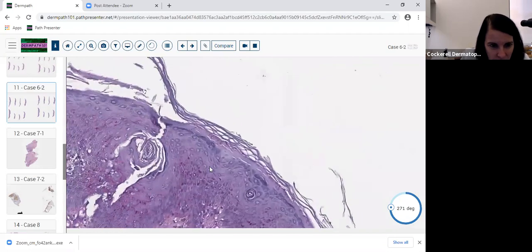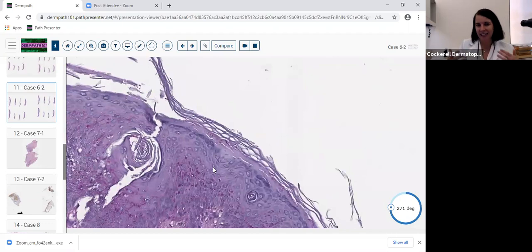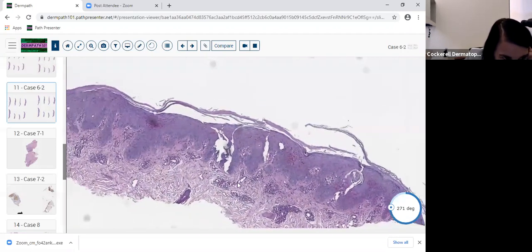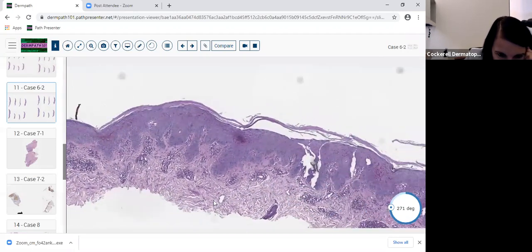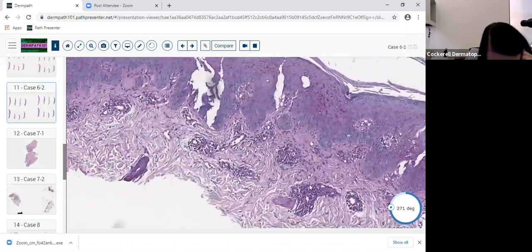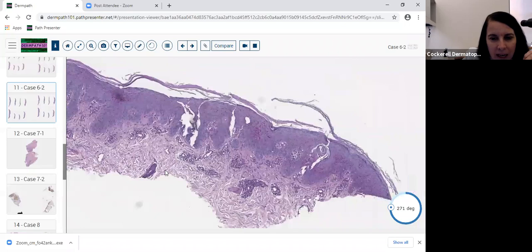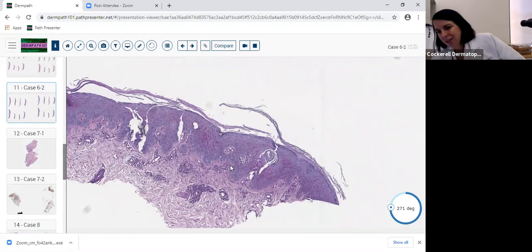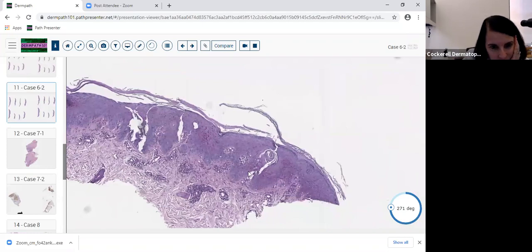Now, when you have a superficial fungal infection, tinea corporis in this case, because it was on the body, if it's tinea capitis, especially in a child, be sure to look in the hairs down here. Take a quick look and try to find some hair. Well, this isn't scalp, so we don't see much hair that we can look at. But you want to make sure you don't miss an endothrix or an ectothrix. Endothrix is when the hyphae and spores, the conidia, are inside the hair shaft, and ectothrix is when it's laying on top of the hair shaft. Because it changes the treatment, if it's an endothrix, they may have to get systemic treatment.